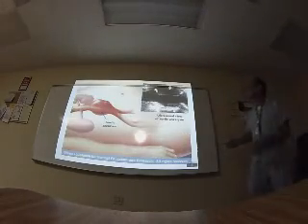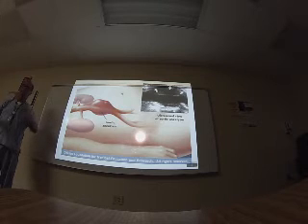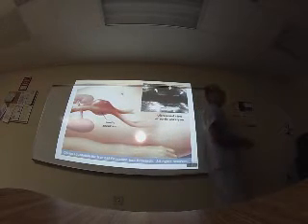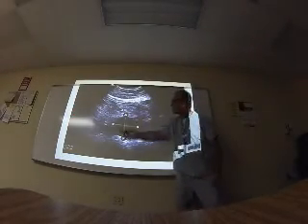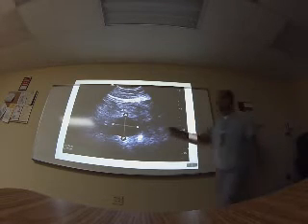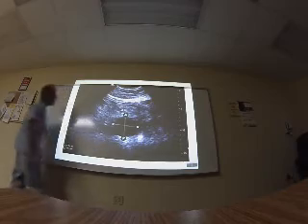You can see here in the picture, in the ultrasound, the aortic aneurysm, a very common protocol. But it is for older people; you cannot find a young person with a problem in the aorta. This is old people, but very, very common. All the week you are scanning 3 or 4 aortic aneurysms. Okay, you can see here in transverse. How do I know this is transverse? Because the anechoic area is round. If I am in sagittal, the anechoic area is elongated.